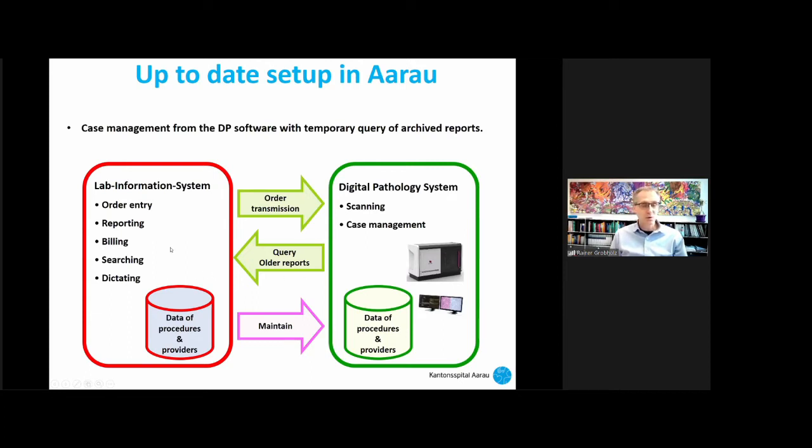In order not to reproduce data and double store them, especially for previous reports and older data, we have an SQL query report that is active only once I hit the case.